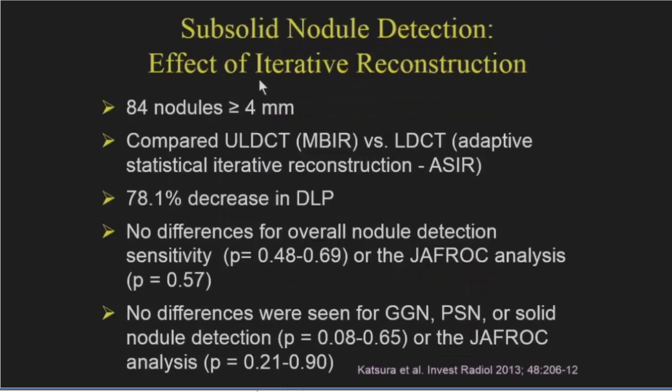And what about the effect of different types of iterative reconstruction on the characterization of the subsolid nodules?